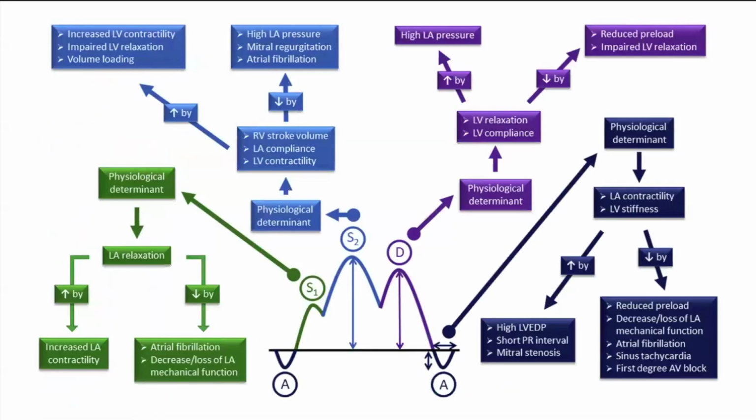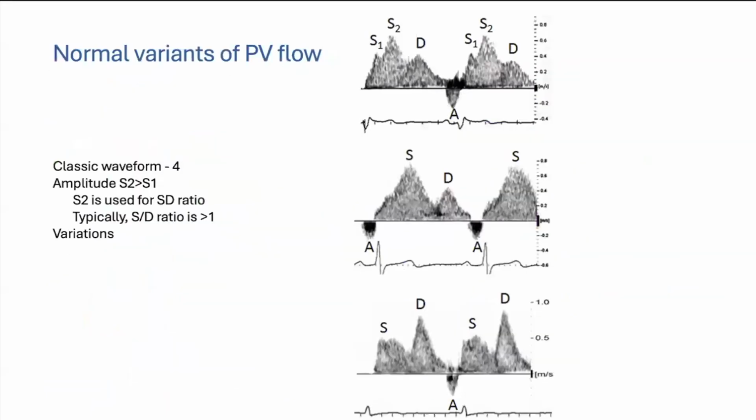Okay, for people who like flowcharts. This is a printed slide, so you can print it, put it in your office, look at it, just for a simple reminder, like quick reminders. And it's from the article. It's a very nice summary of what I was just saying now.